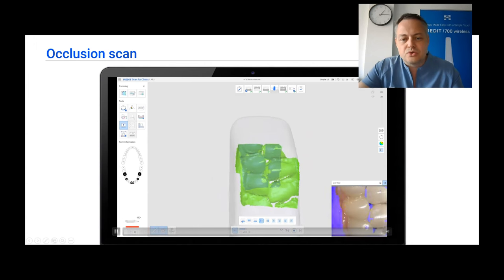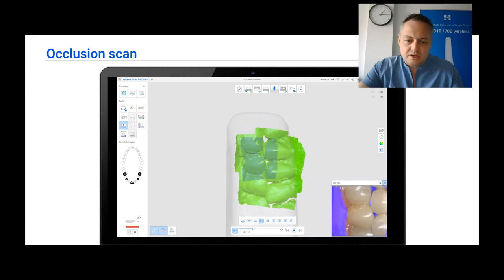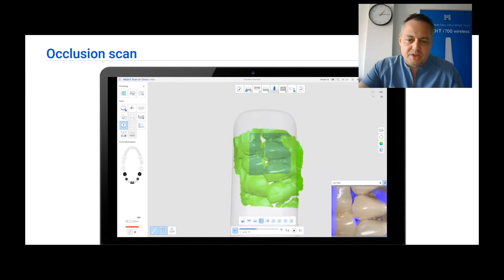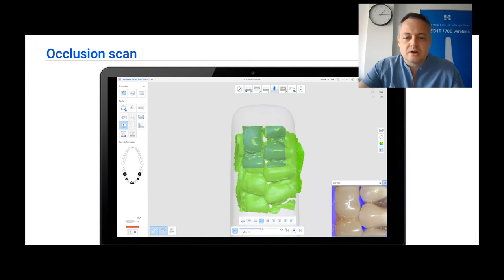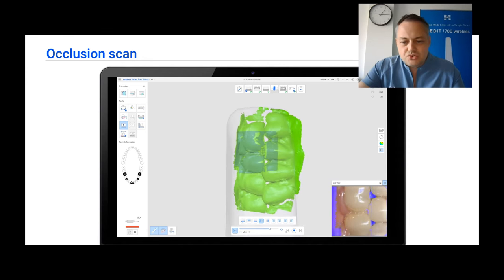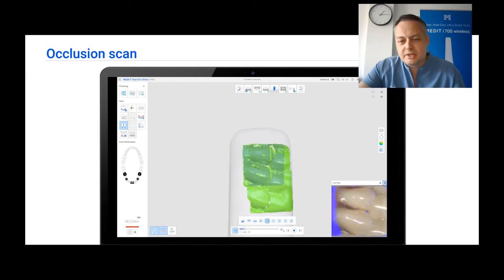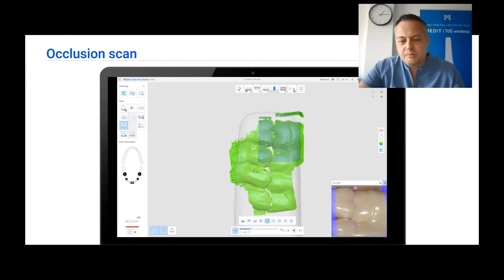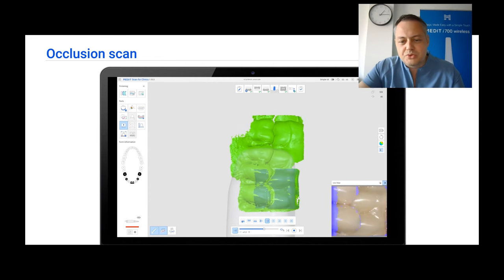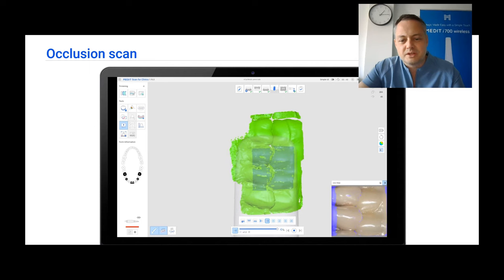Now we are going to scan the occlusion — starting from the canines and going to the molars. I am trying to really get as much detail here as possible on both sides to be able to get a good fitting of the final prosthesis.